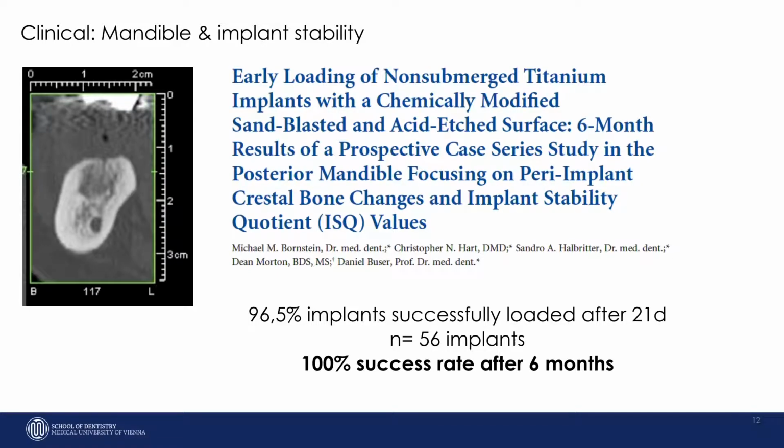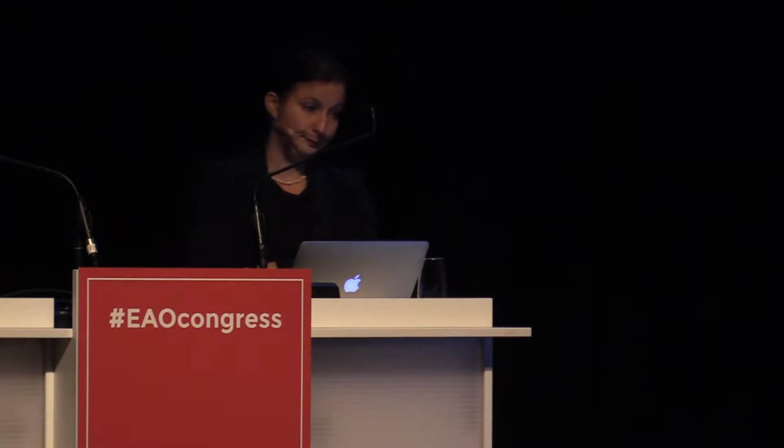As I mentioned, I started in Bern, and the Bernese group does a lot of implant stability measurement, and they could shorten the implant healing periods based on scientific research. You can see that in this study they loaded the implants after 3 weeks, and they had a 100% success rate after 6 months, and 96% of the implants in the posterior mandible could be loaded after 3 weeks, which is really incredible for this time, where the implant healing period was like 3 months.